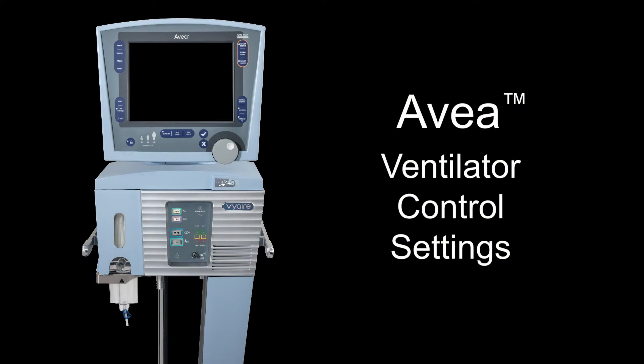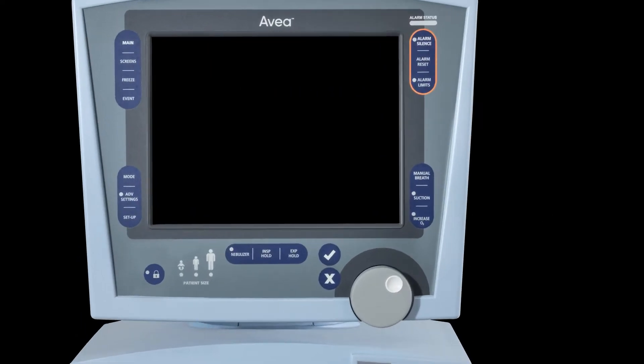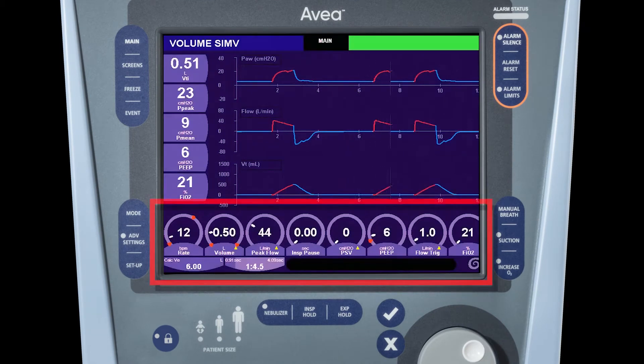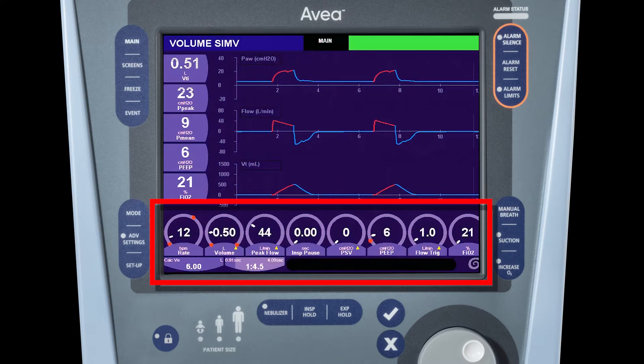We're going to review the control settings on the Avia ventilator. As you can see, the controls can be found along the lower edge of the display screen.